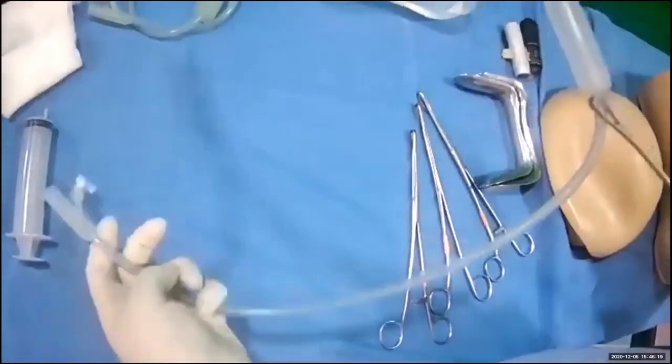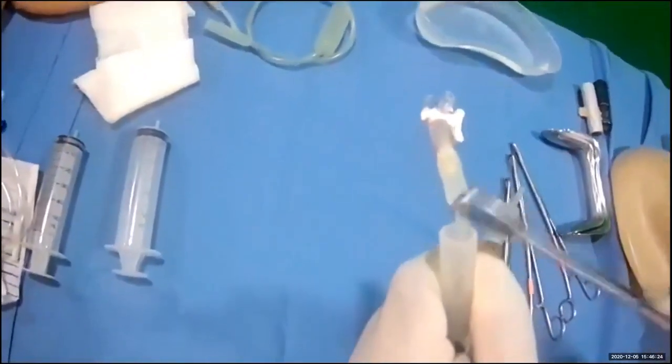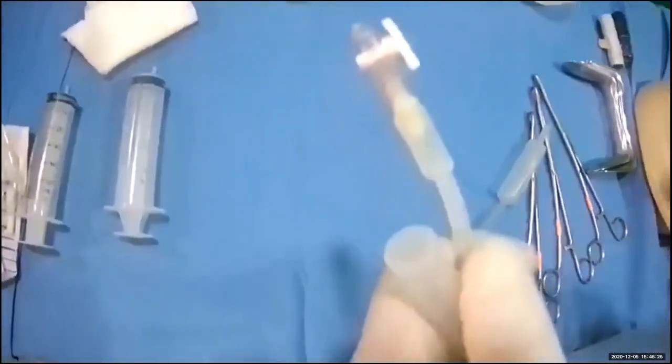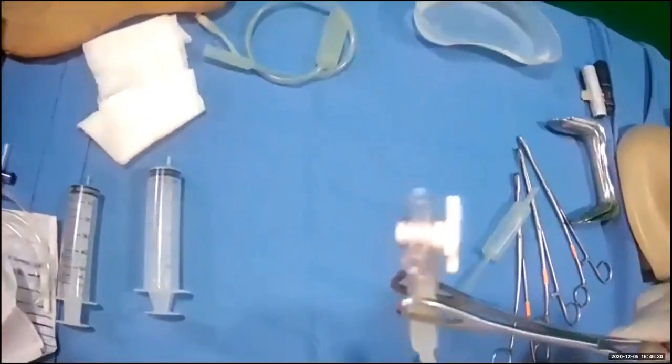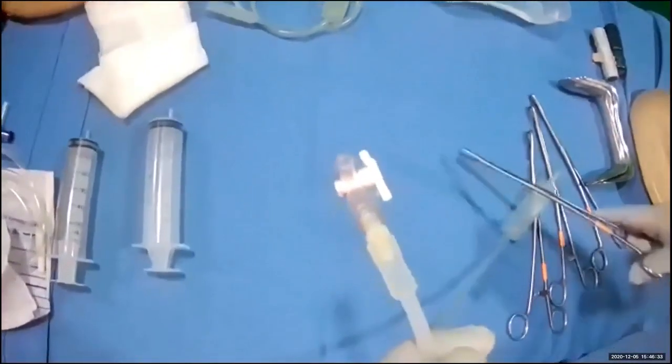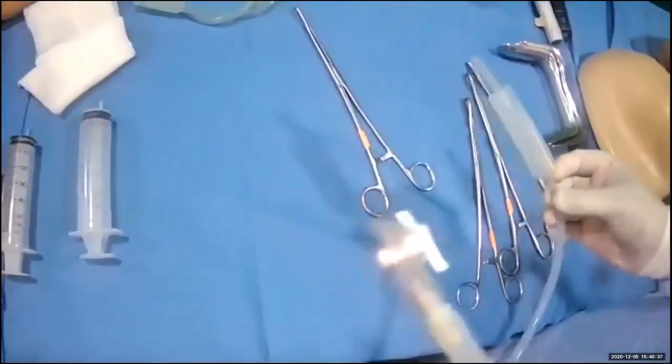It has two orifices. One orifice is where you insert the CBD bag to drain the blood, and the other orifice is for you to infuse the saline to inflate the balloon. Next, I'm going to demonstrate how to insert a Bakri balloon tamponade.